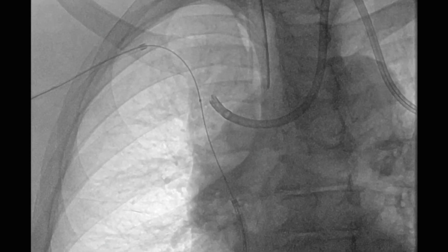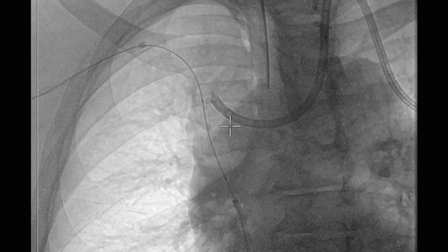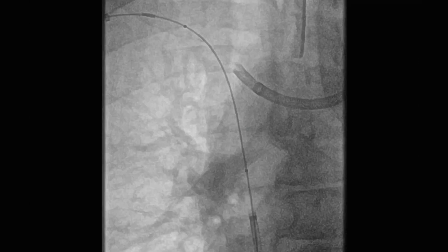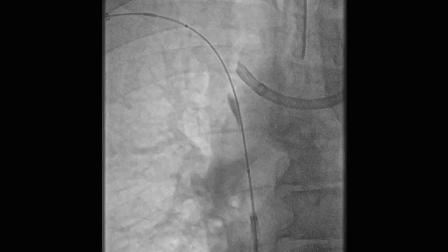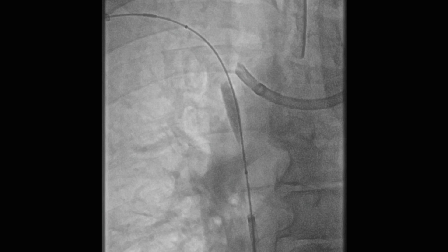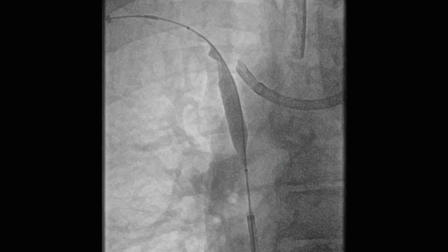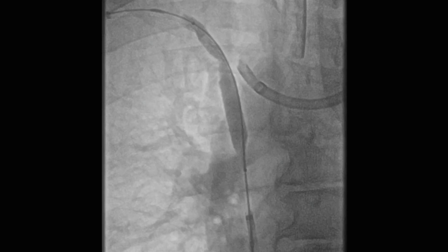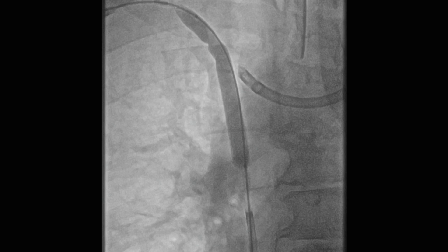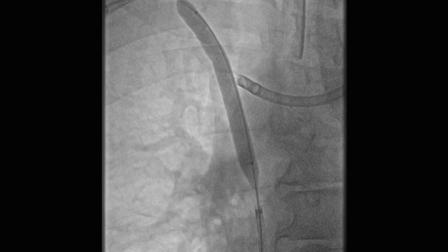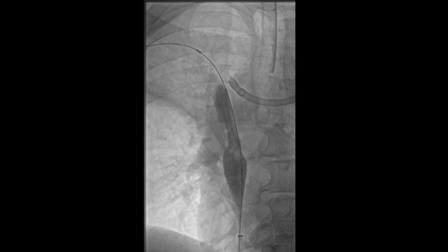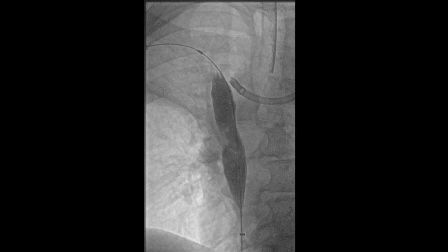Once we had completed that, we exchanged the soft-angle glide wire for an Amplatz wire to give us more support, and proceeded to perform angioplasty of the previously occluded segment, initially with an 8-millimeter balloon, which was then upsized to a 12-millimeter balloon, and then a 16-millimeter balloon.